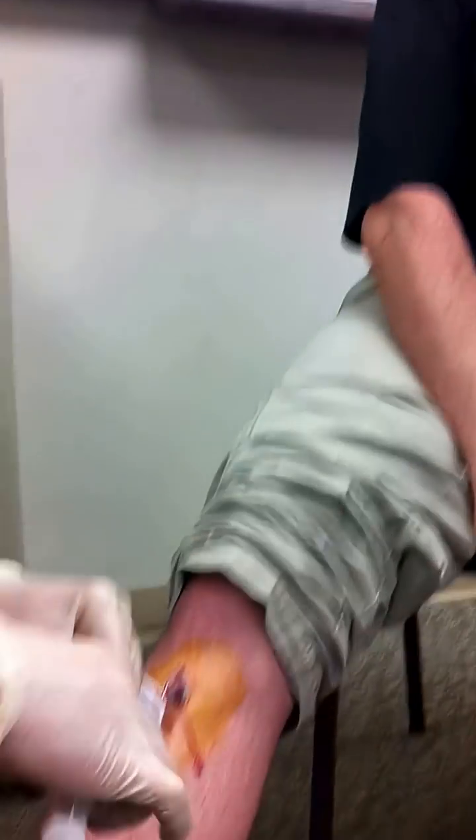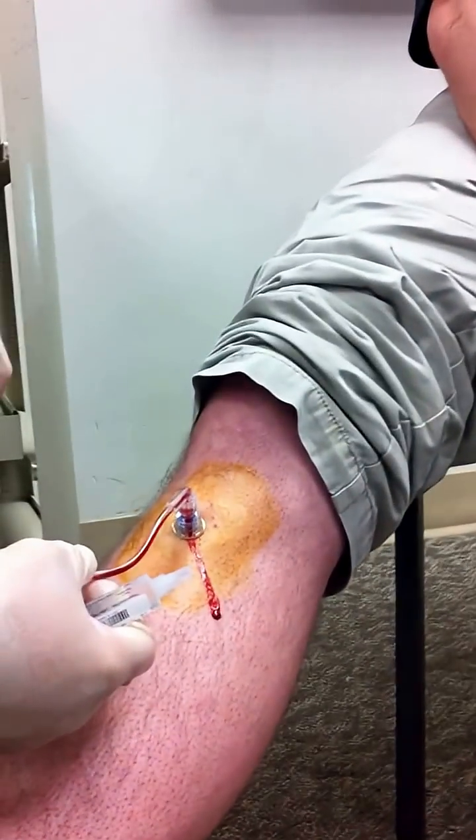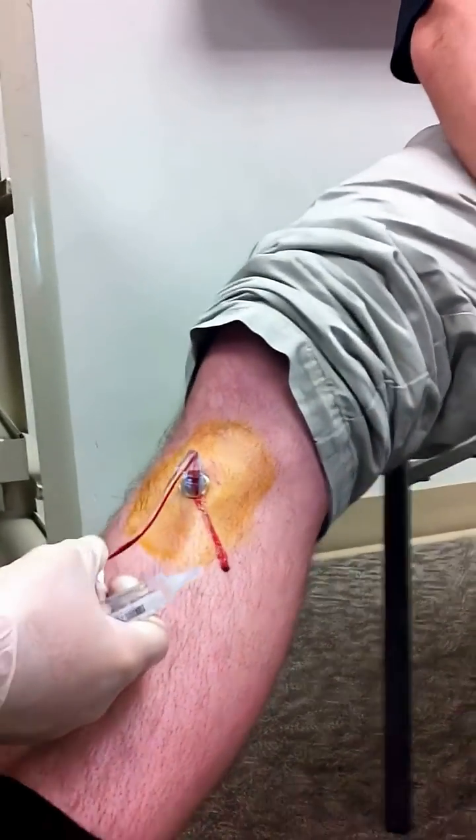Okay, now how do you take it out? I want to pass out. We can demonstrate that next — put the drill back on and press reverse. The proper procedure for taking it out is you take a syringe. You okay? Yeah. You want to wait a minute? Let's let it hang out, just a snack.